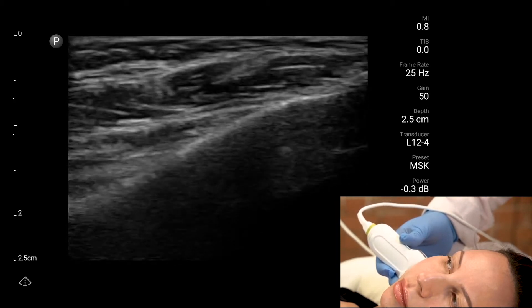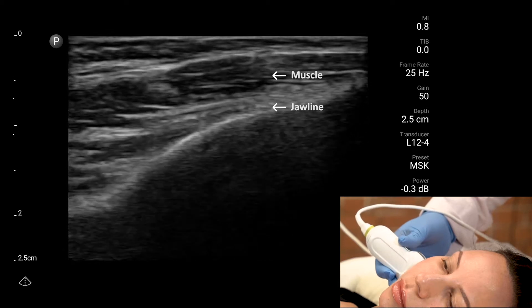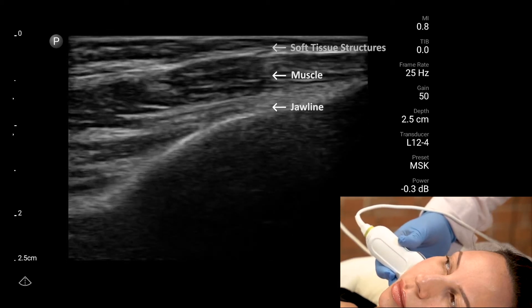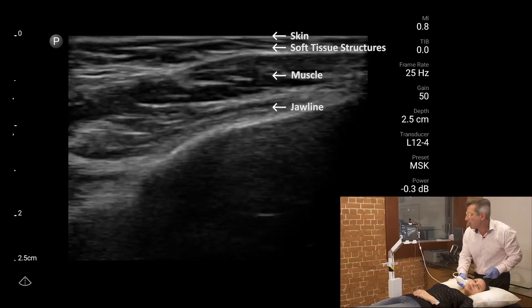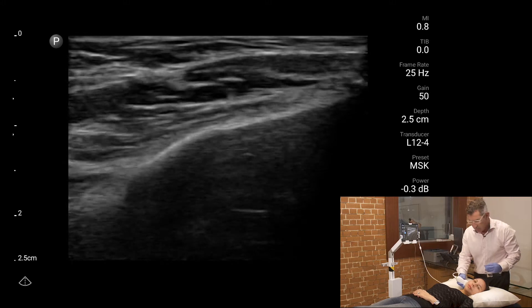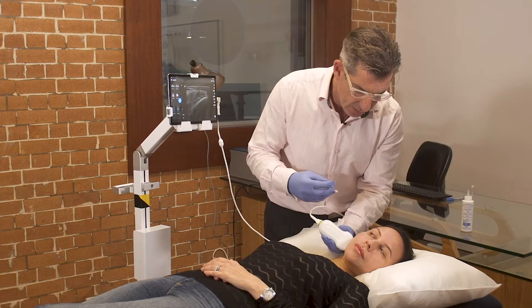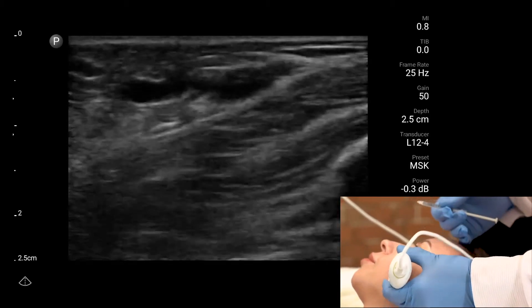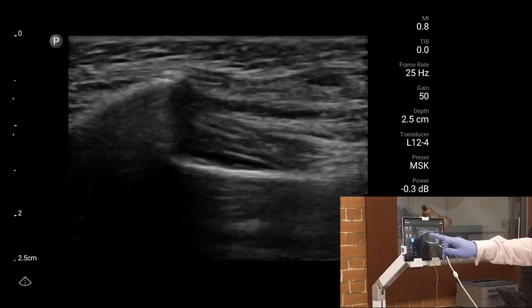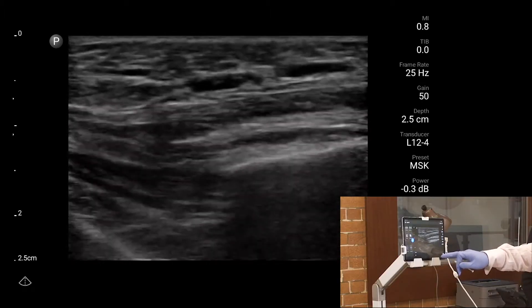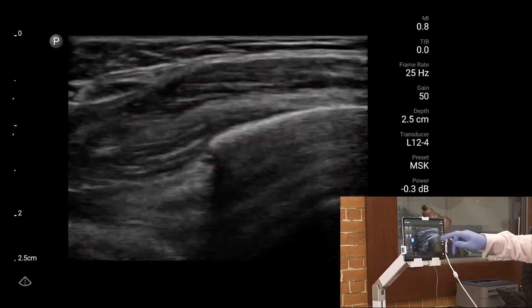What you can clearly see on the ultrasound is the jaw line, then the muscle lying superior to that, and just overlying that some soft tissue structures and skin. The depth I know is one centimeter and I'll take the appropriate needle. In a masseter I would typically inject 20 units per side at two sites. The ramus of the mandible, lower part of the mandible, with masseter muscle overlying that and soft tissue above.